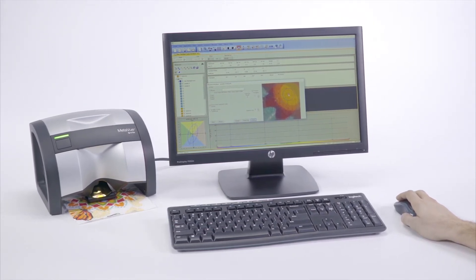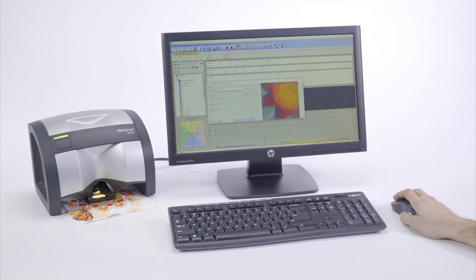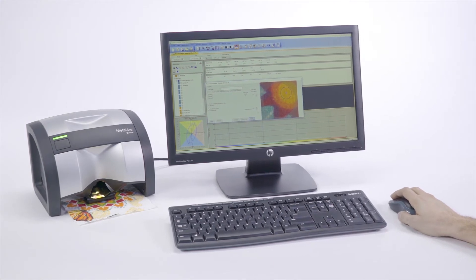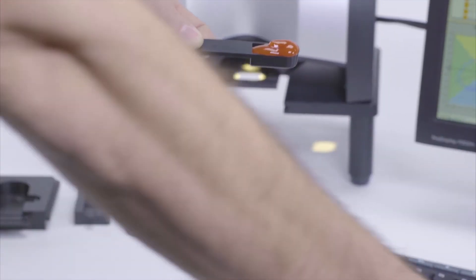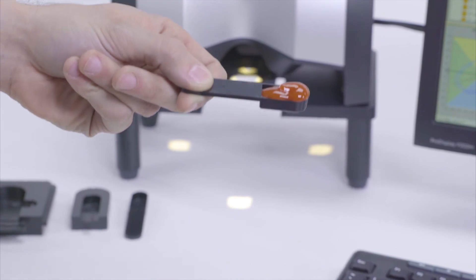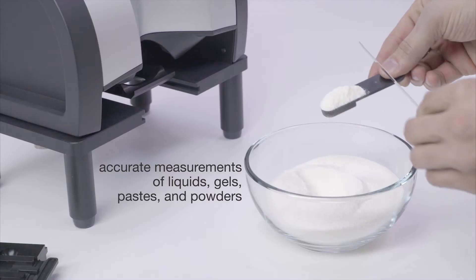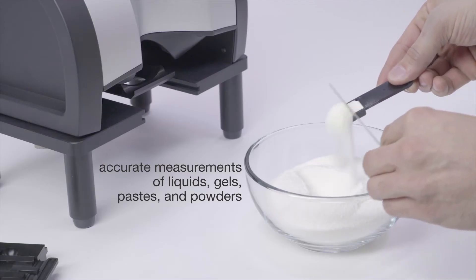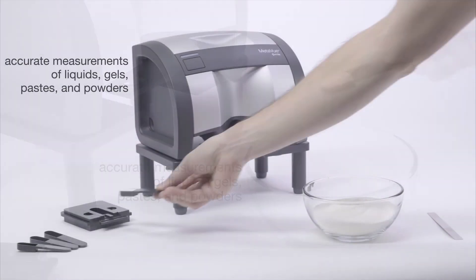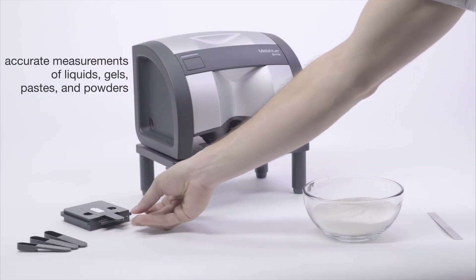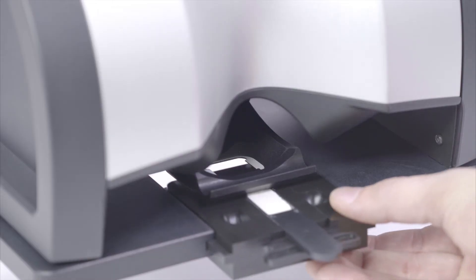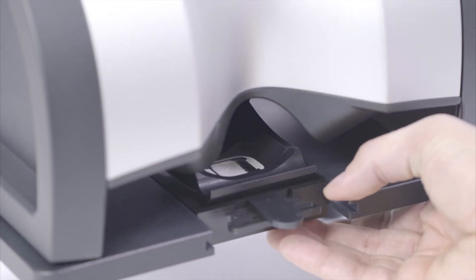For precise, fast and easy selection of the target area, the non-contact measurement feature, a true differentiator, makes it easier to get accurate readings even with challenging samples like liquids, gels, pastes, and powders.